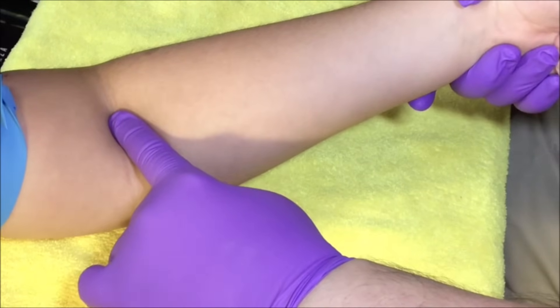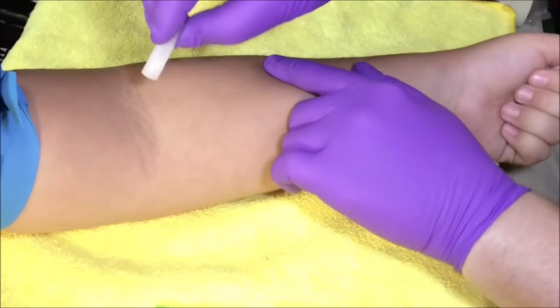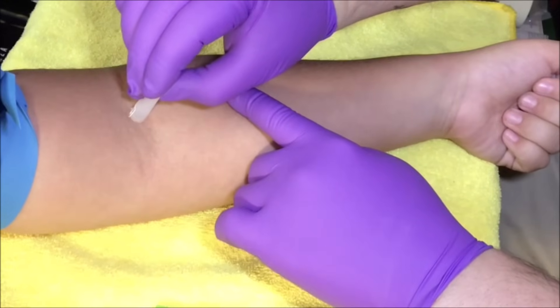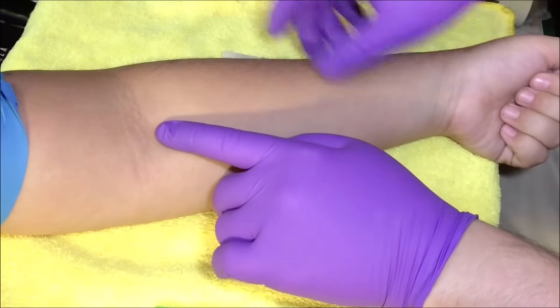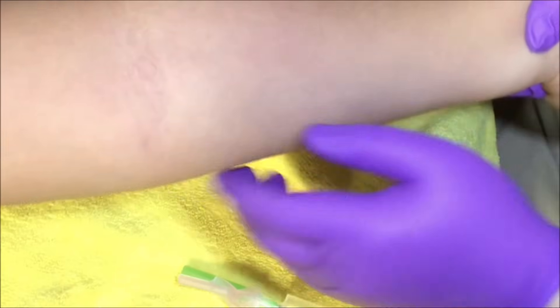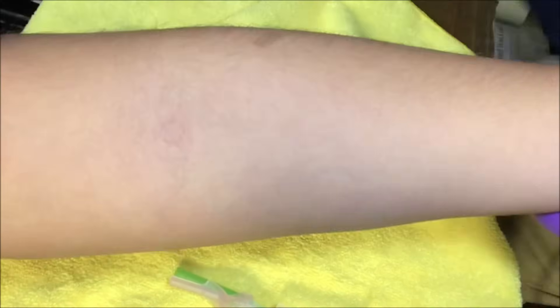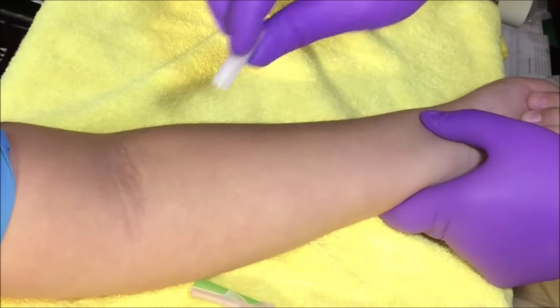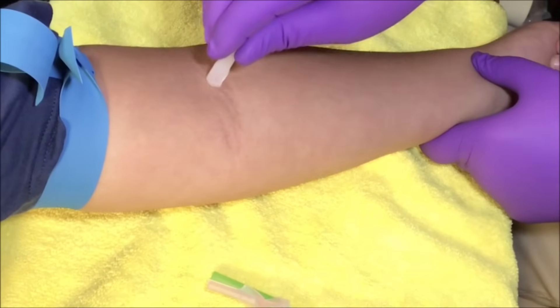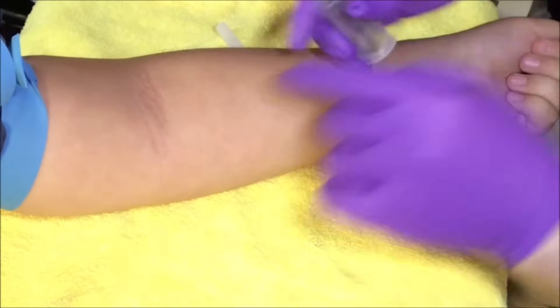Once I find it, I'll take this little cap that I took off the needle and put it where the vein is. I'll push down on that site for a few seconds, then lift up — there should be a little mark left on the arm. That impression is left from the cap. Do not twist it — just put a little pressure on the site, push down, hold it for a few seconds, lift up, and that should leave a little circle that tells you where you want to put the needle.